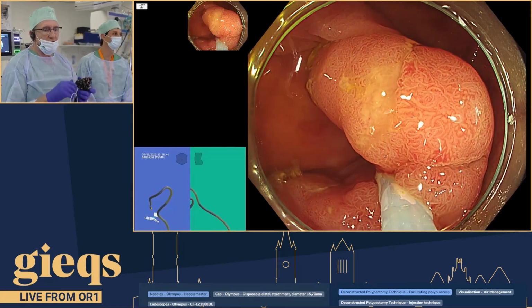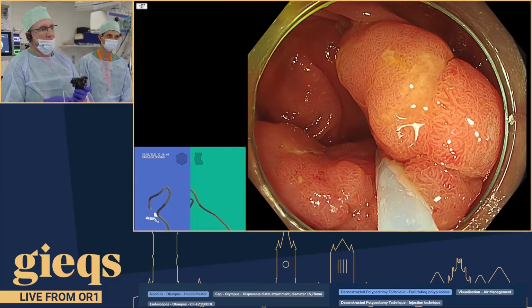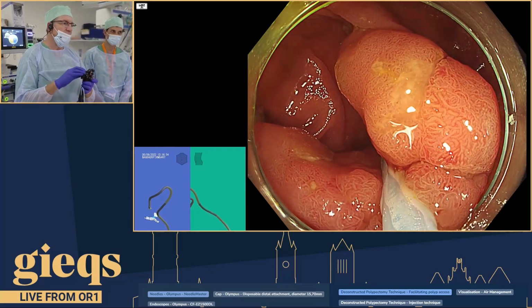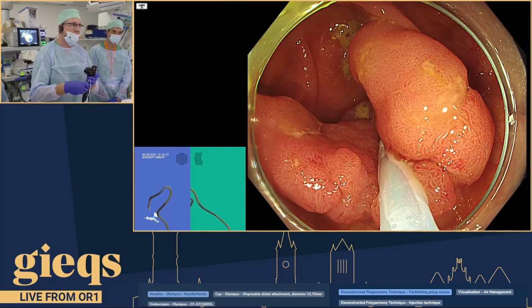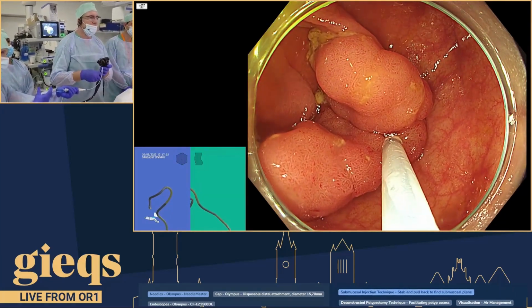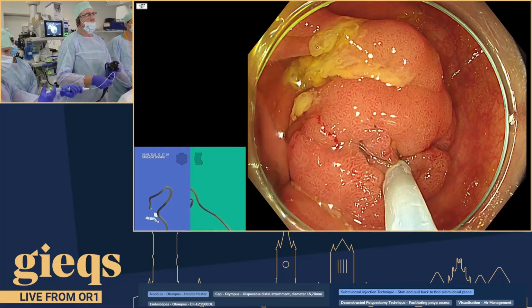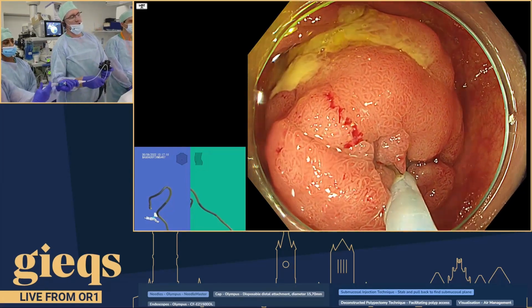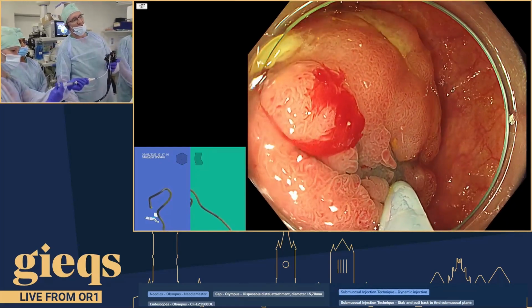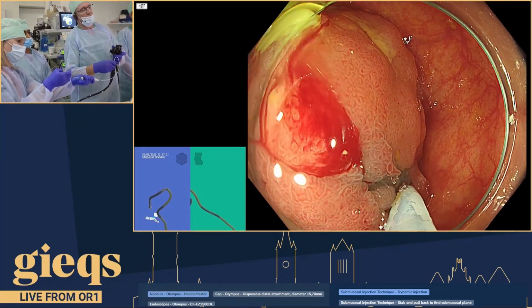So I ask Evie to put the needle out for me. And then I drag back a little bit till I see the edge of the catheter, which is just going to appear just here, around about here. And now I'm going to inject, and we make a stab, inject, go. And we want to bring this polyp, so this is dynamic injection. I pull back a little bit, keep injecting, and I want to pull this polyp out of the cecum and into the ascending colon. Needle back.